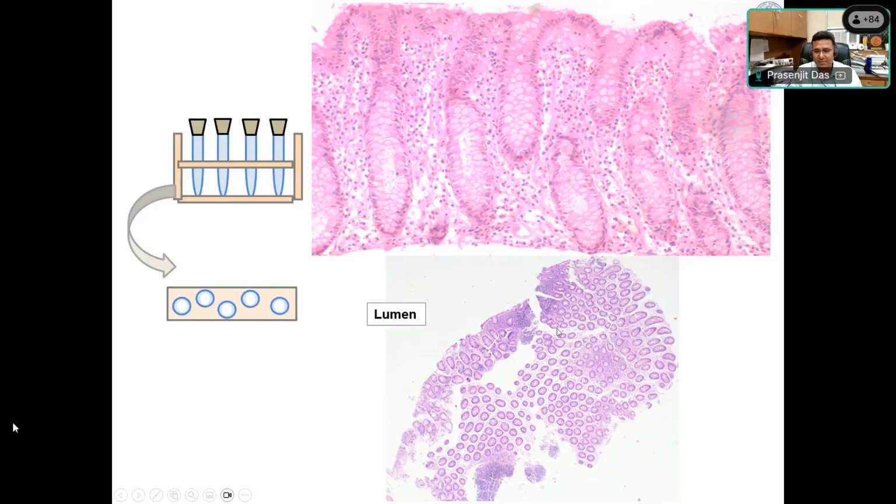And if you take a cross section of this, what you will see are rounded crypts. That actually happens when the biopsy is not oriented. We see the rounded crypts. It is a cross section, but still you can determine the distance in between each crypt, that is well maintained, and they are not expanded or irregularly distributed. Okay, that was one point she told very nicely.